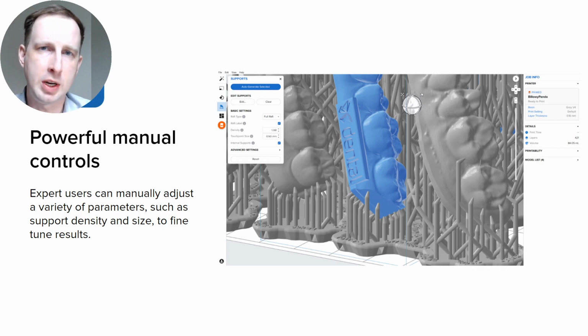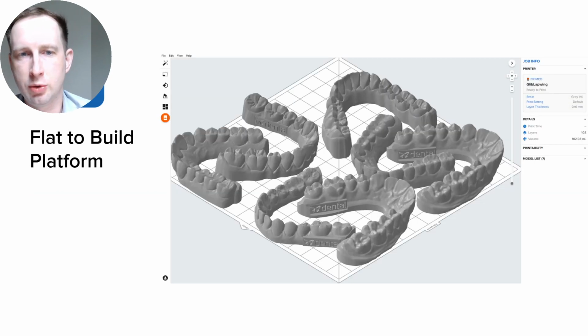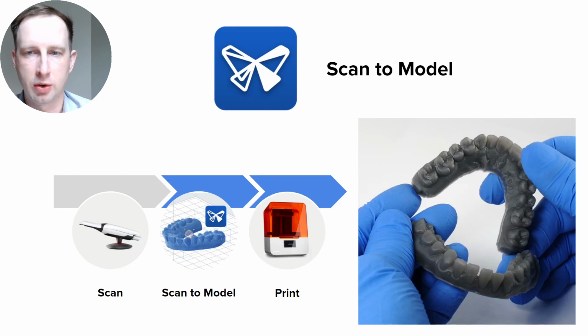Preform is a free-to-use software which is very intuitive, but also has some really powerful manual controls once you dig a little bit deeper. And what it allows you to do, pretty much, is job setup, nesting, CAM. You take your manufacturing STL files and you virtually place them on the build platform. It can check to make sure it's got correct printabilities. It can estimate material usage, print time, and all that. And then you send the job to the printer. You can lay them flat on the build platform, and you can also do them vertically as well.